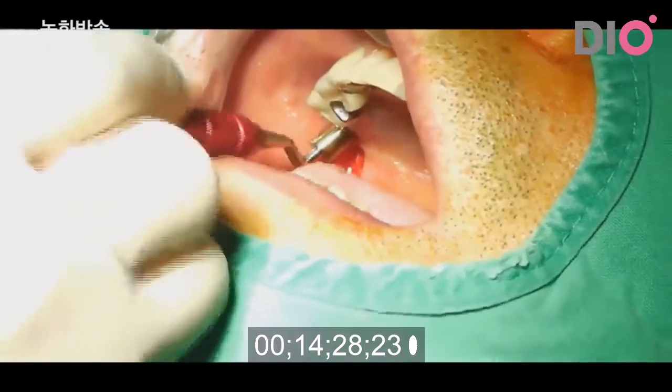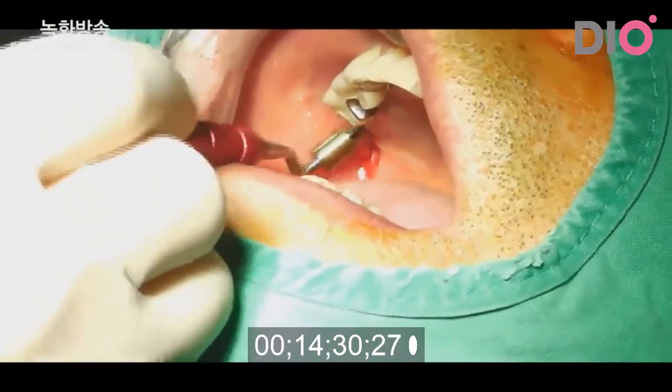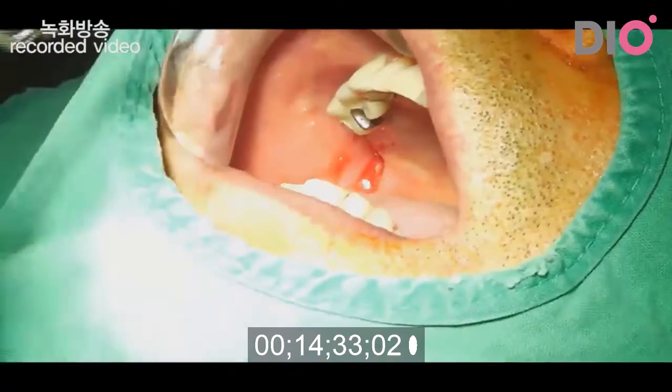Okay, I finished inserting the material into the sinus cavity in the second molar area, and then I will start in the first molar area.